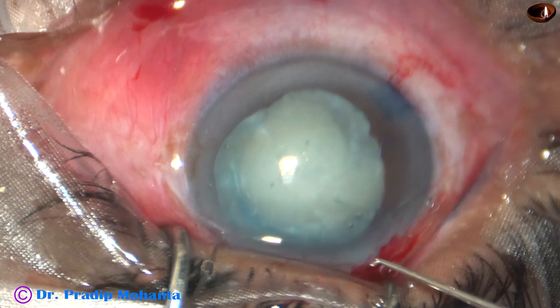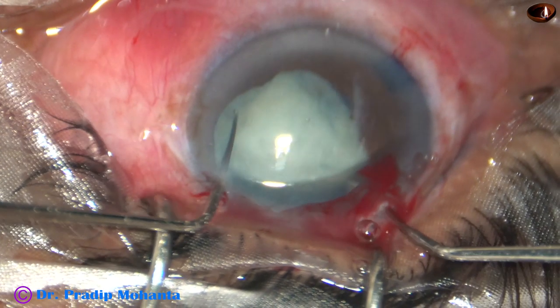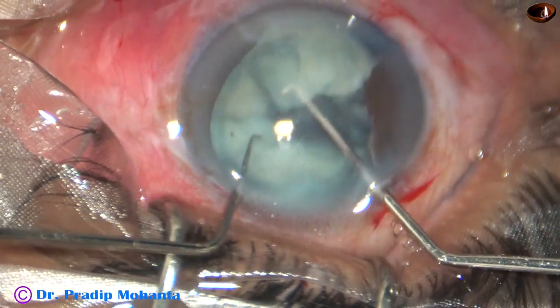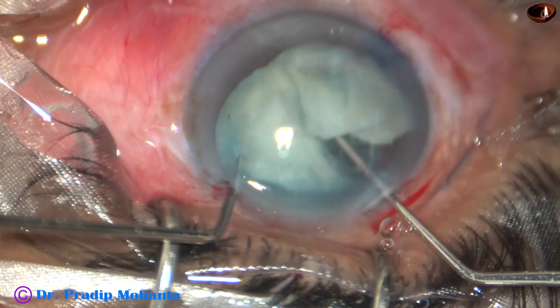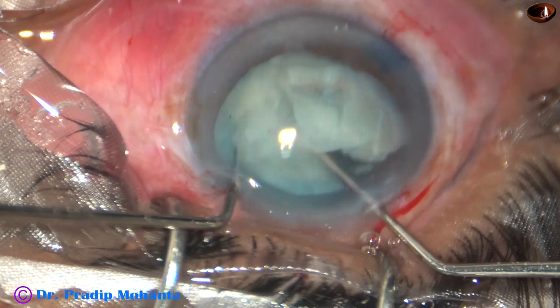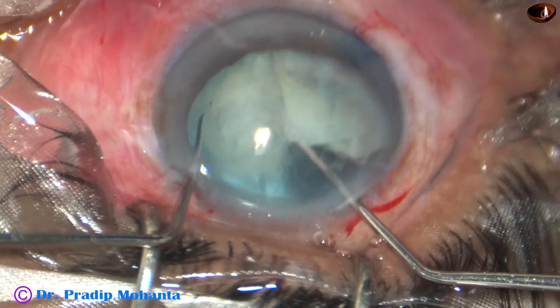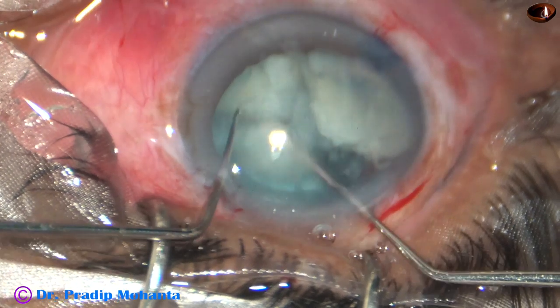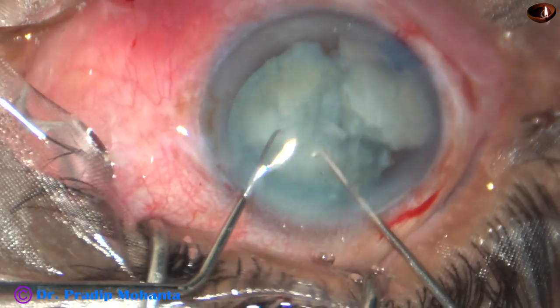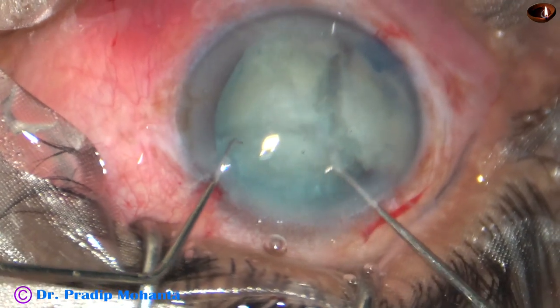My plan is to divide the nucleus using two instruments — two Sinski hooks. You can call it pre-chop of the nucleus. This is because I didn't want to exert pressure of the fluid on the posterior capsule. I don't know how far the capsular tear has extended — I hope it has extended only to the zonule and has not extended posteriorly. By these two instruments, I have divided the nucleus into three fragments. If the nucleus is soft, we can just use two Sinski hooks and divide the nucleus into fragments.